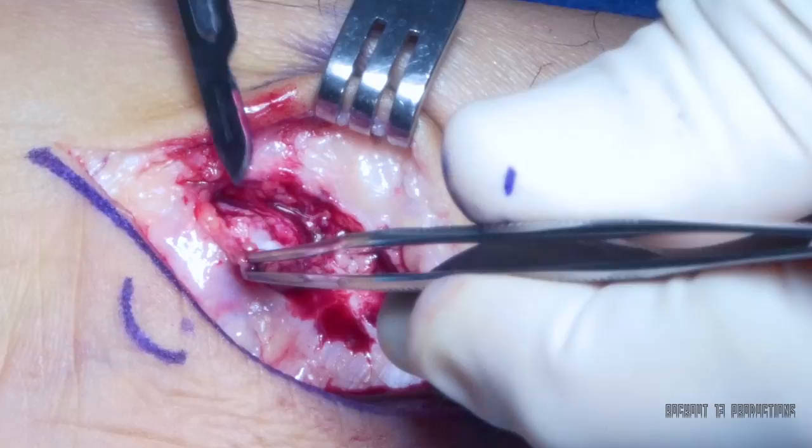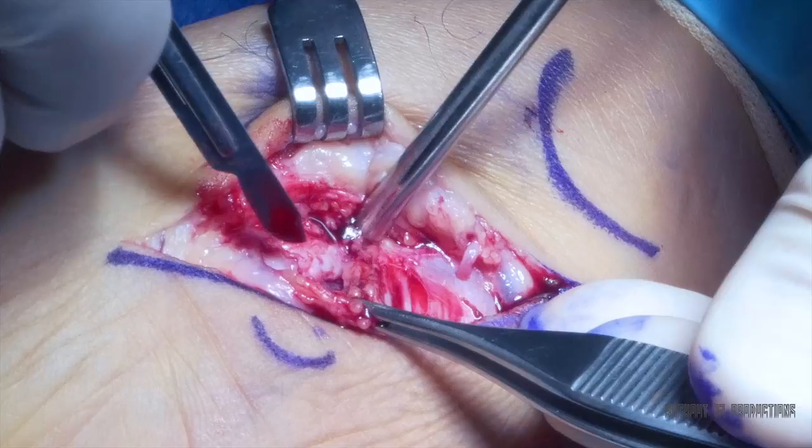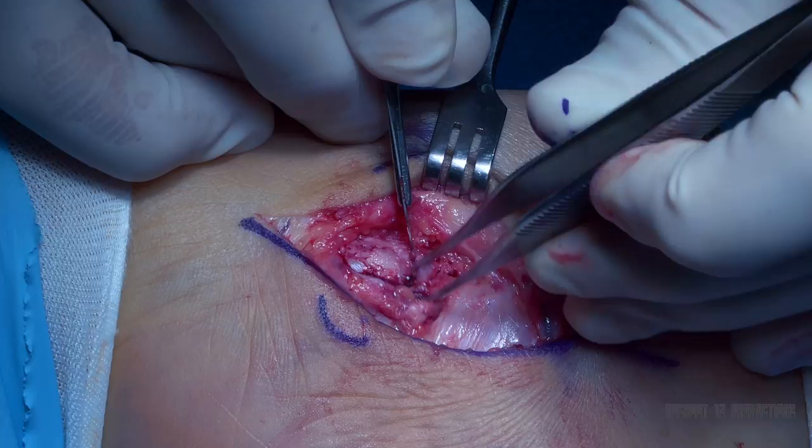A sharp incision is made over the periosteum along the dorsal medial navicular so as to preserve as much of the posterior tibial attachment plantarly as possible. The periosteum is sharply dissected and the navicular tuberosity exposed.